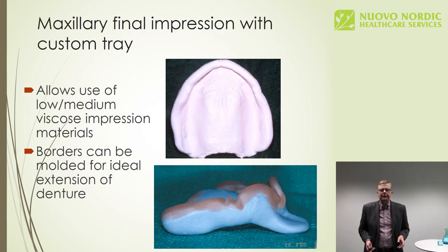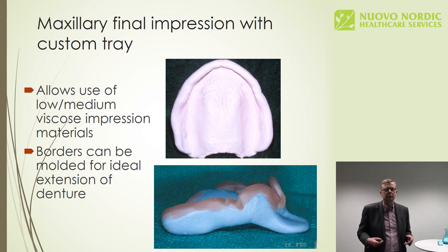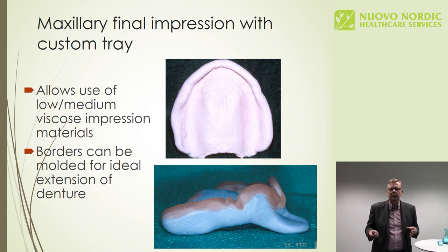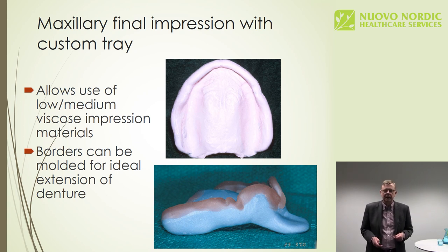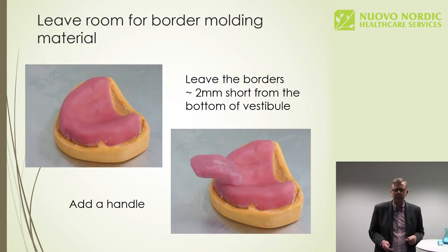In the maxilla, as I mentioned, we'll use the custom tray for the impression, and this is because we want to maximize the suction cup effect. For the maximum suction cup effect, we'll mold the borders of the denture, as you can see in the lower picture. Just a little bit more about that later.